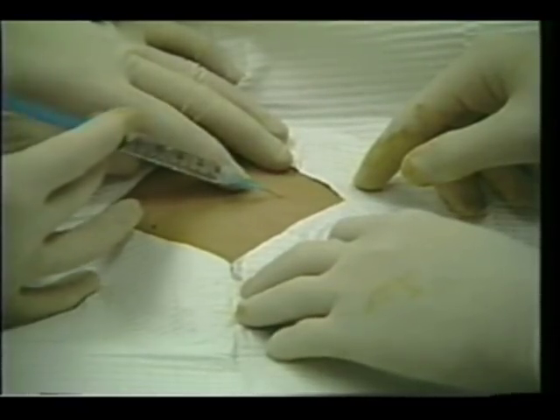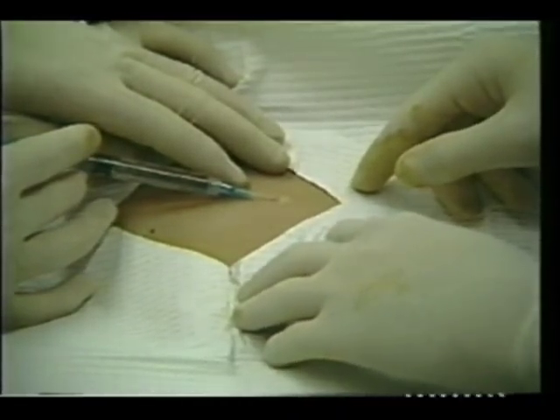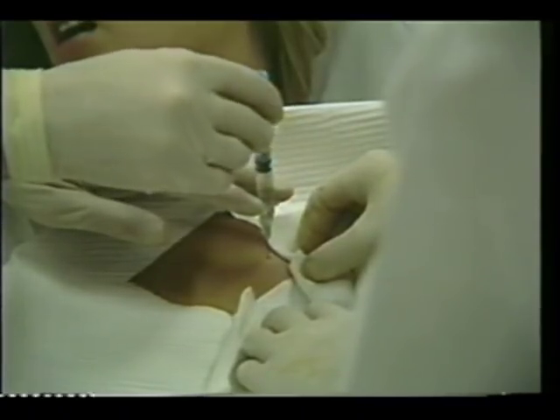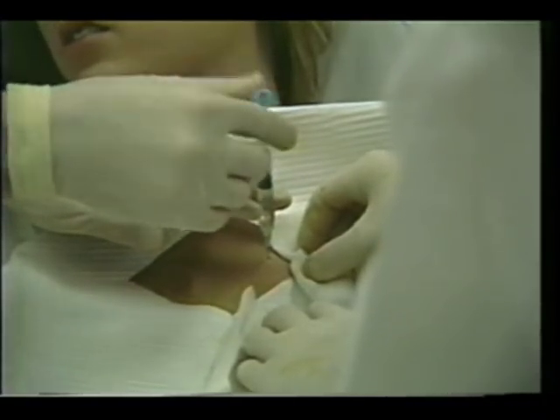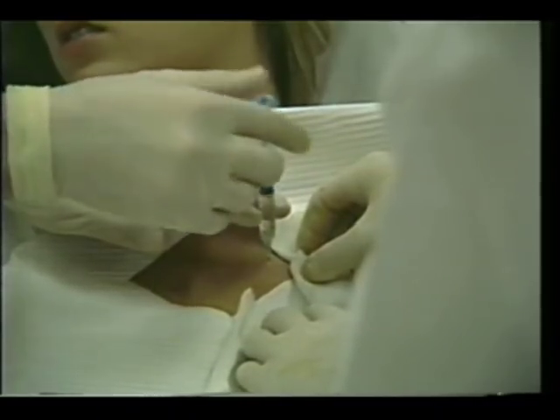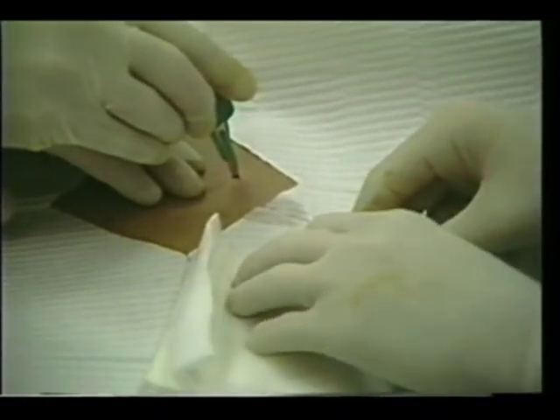Local anesthesia is administered at the selected site. A 3 cc syringe with a 25 gauge needle and 21 gauge needle are provided. Using the provided scalpel, a small skin incision is made at the site.